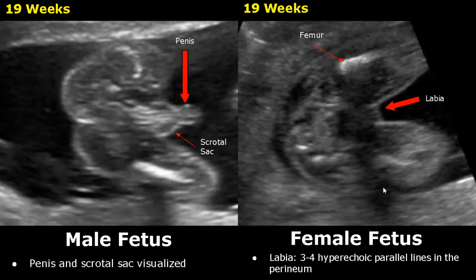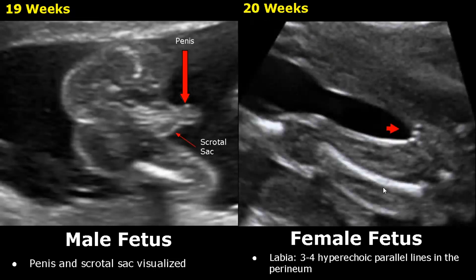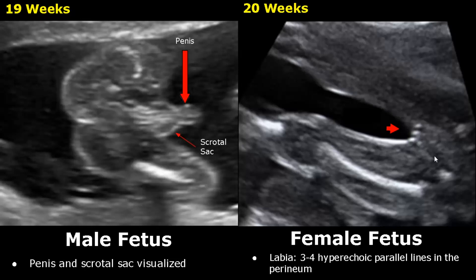This is an image of a female fetus of 20 weeks. We can see the labia — we can see three parallel lines. In this image they are not appearing as lines; they are somewhat appearing as dots, but it is still helpful in determining the gender.